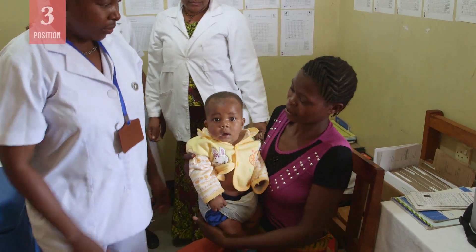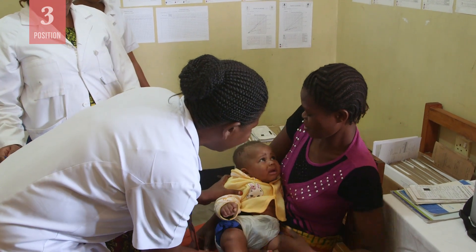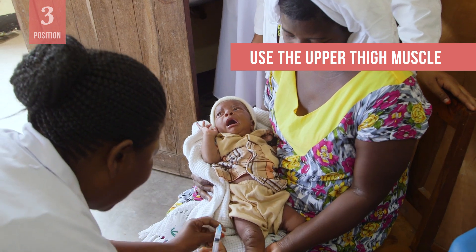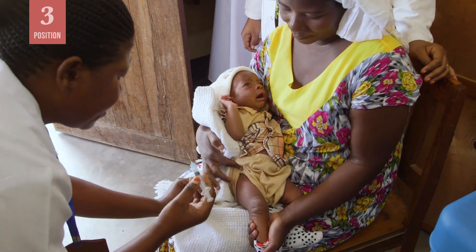Let them know that holding their child properly will help keep the child calm and still, which will make the immunization go more smoothly. Position the child so that you can deliver the vaccine in the upper outer part of the thigh. This muscle is large and safe for intramuscular injections.